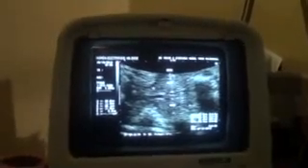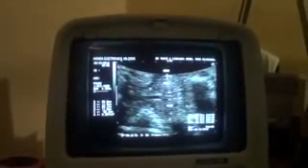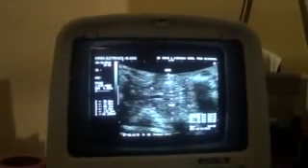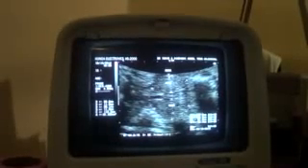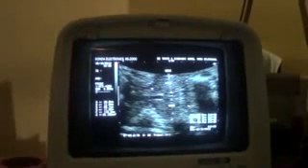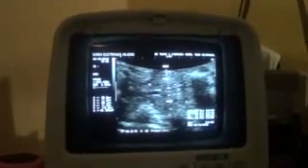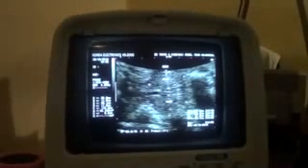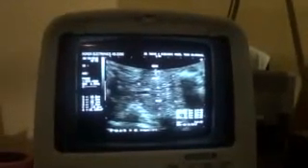The cause of polyhydramnios is this solid, evenly echogenic, well demarcated mass relating to the anterior neck with vessel traversing the center, having no calcification, with no shadowing, no cystic area within it. There is no cystic area seen within it and is well demarcated.